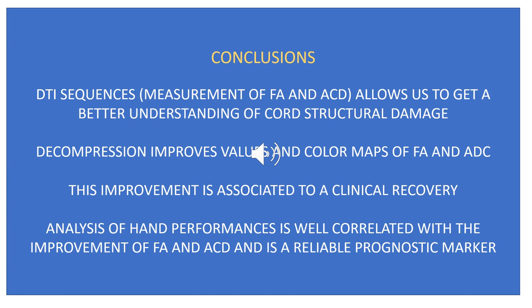Analysis of hand performances is well correlated with improvement of FA and ADC and is a reliable prognostic marker. Thank you very much for your attention.